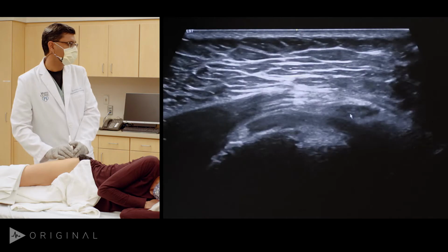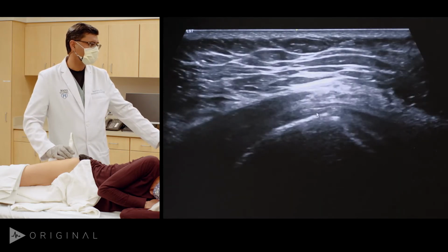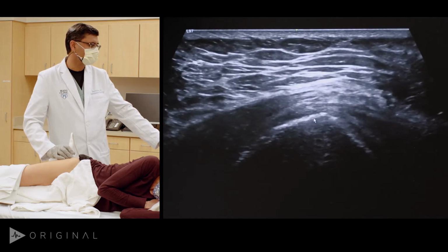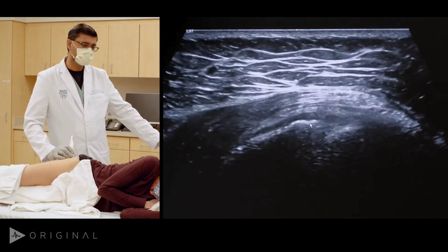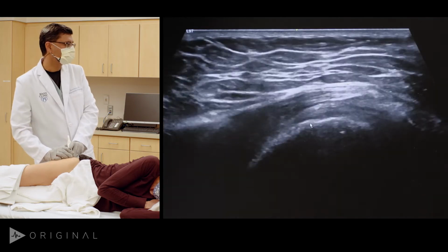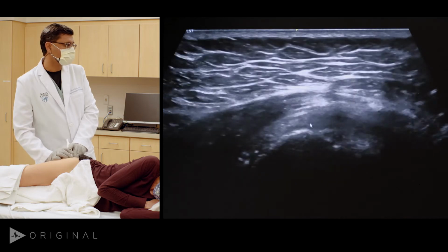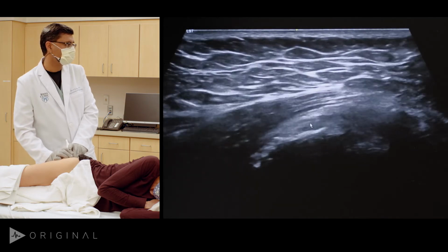When we swing posteriorly, we will have what is called the bare area of the lateral facet. So we don't want to find the tendon there. The tendon's slightly more posterior than you expect. So you find your ridge, go posteriorly, and now again, this is the tendon here. You want to make it nice and white, you can see it there.